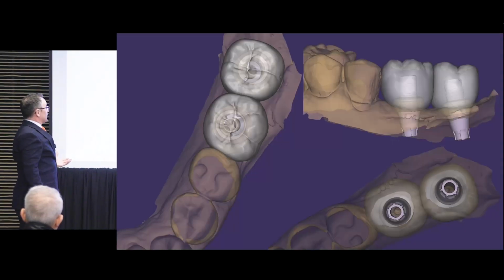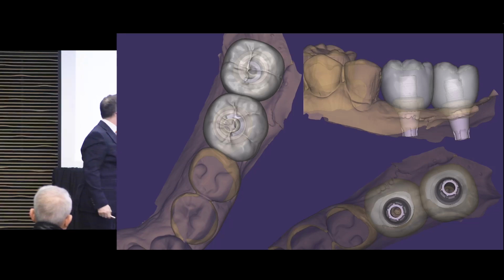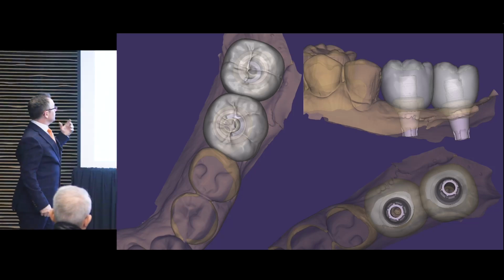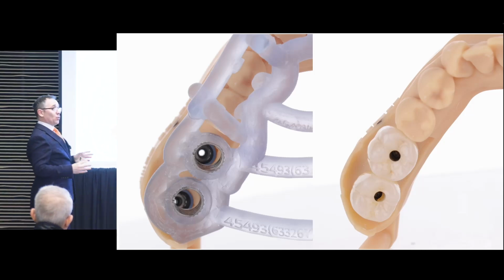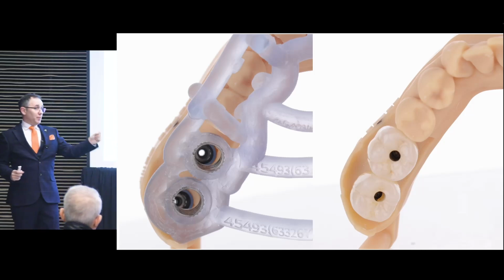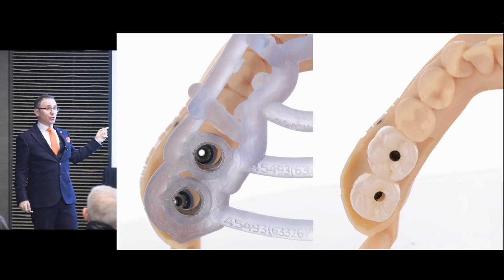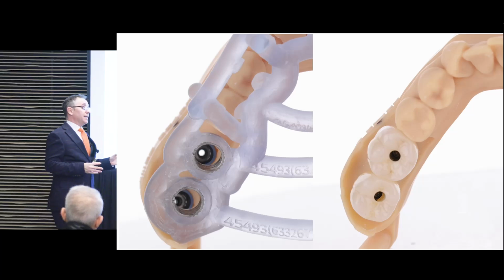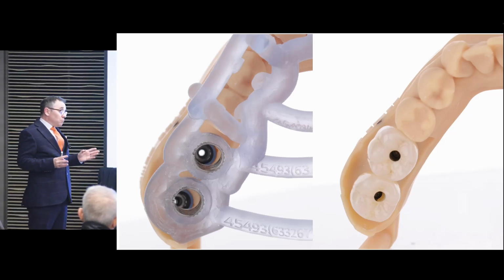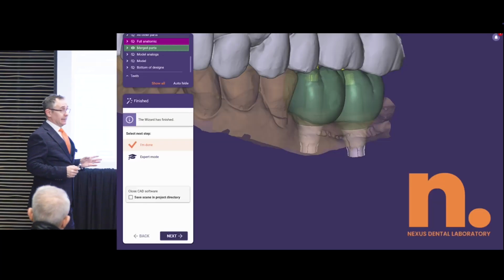And giving credit to Martin, he's here amongst the technicians, but obviously this surgeon's here. Why did it work so well? Because it was planned. Honestly, my number one takeaway for everyone here is, with a bit of planning at the beginning, you can utilize so many more of these solutions and avoid custom abutments. 90% of the cases I do are custom abutments. I would say at least half of them could easily have avoided that, easily.